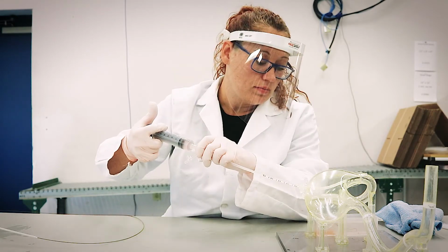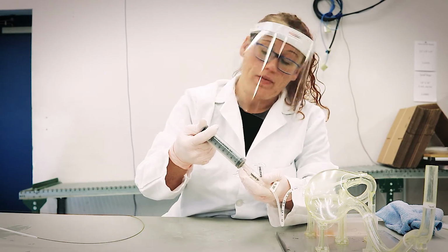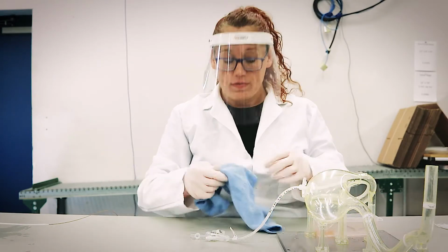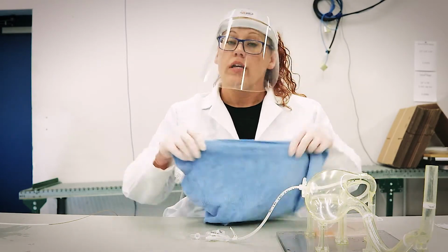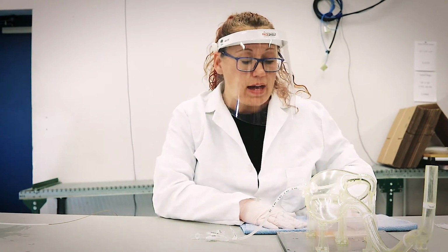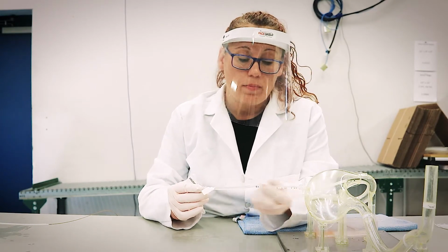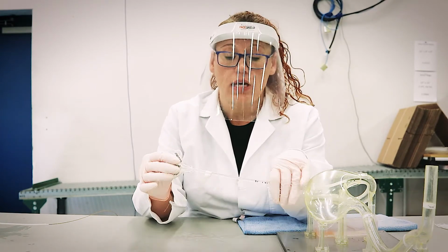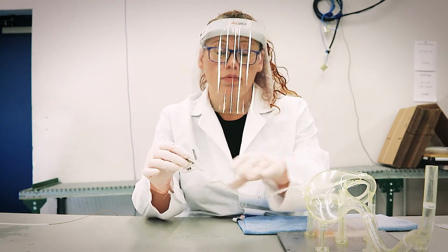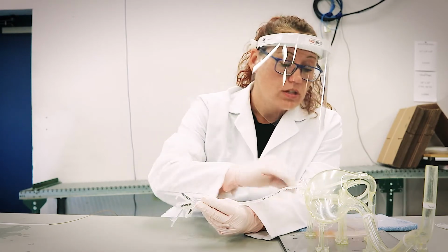There we go. Now, all 15 cc's went in. It was a process. It's good to take a break if you feel like you need a break or you're getting tired or you just want to let it soak. Do that. It's those short motions, being sure to try to stabilize your neck as much as possible, because that is where a lot of your efforts get lost in translation from here to the tip of the clearing stem.